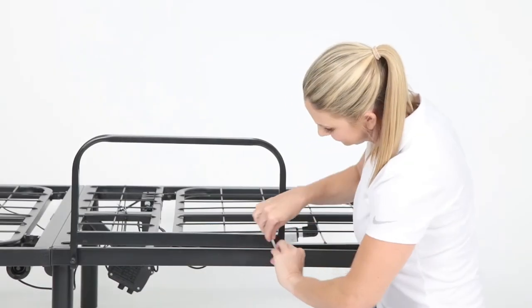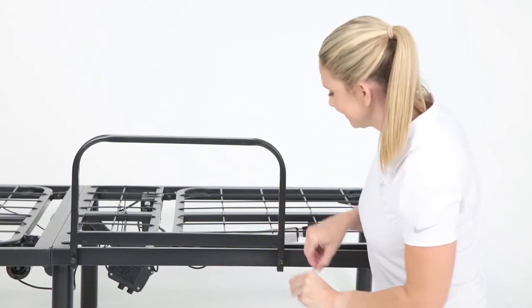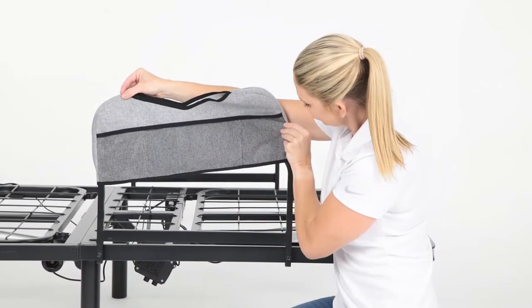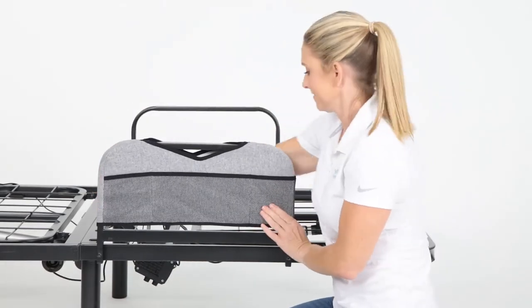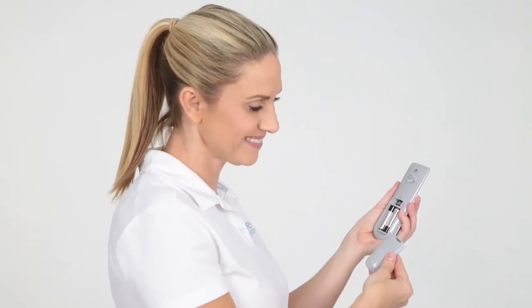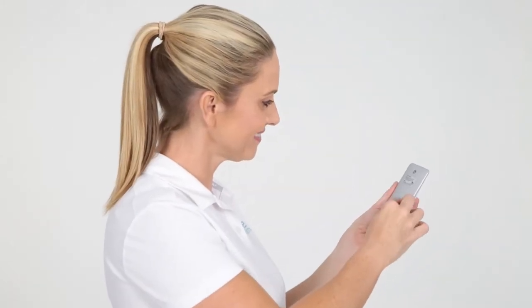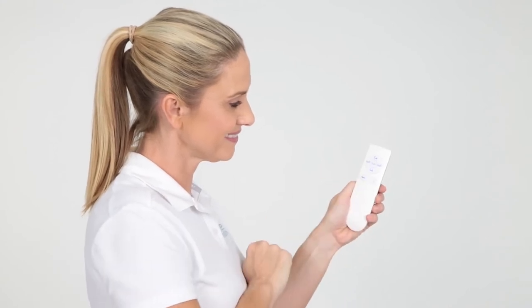Next, install the two armrests onto each side of the bed frame using two long screws labeled G. Then simply place the side bag over the armrest of your choice. Install the AAA batteries into the wireless remote, then be sure to familiarize yourself with all the controls.